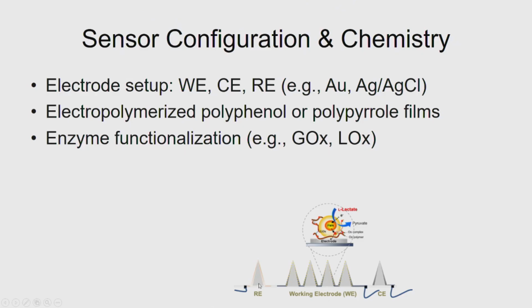So you've got to be very careful. So make sure that you have entrapped films there as well. This here is a cartoon showing you how a microneedle array looks. You can see here you have a reference electrode which looks a bit pinkish in color because it's a silver electrode which has been modified into a silver chloride reference electrode. Very easy to do that.